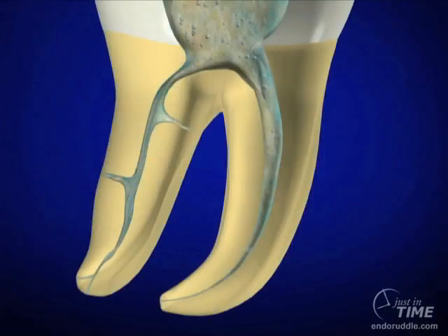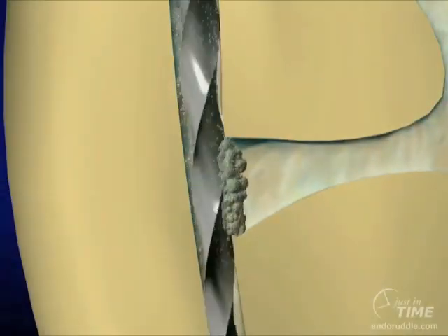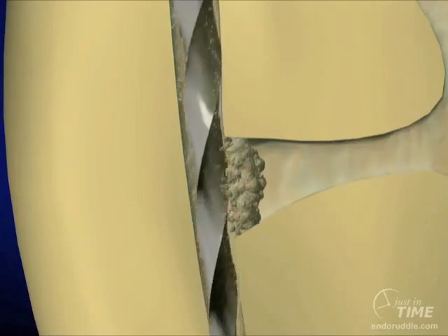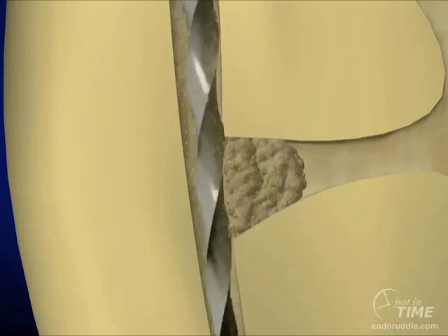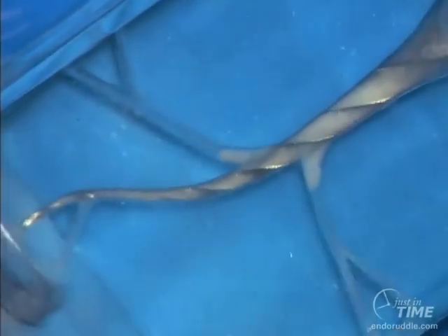Many clinicians relate a blocked canal to the inability to pass a 10-file to the full working length, but in reality, especially with the advent of nickel-titanium instruments and with particular emphasis on the cross-section of the file, many blocked canals are in turn blocked laterally. Rotary nickel-titanium instruments, especially the radial-landed variety, tend to burnish more debris into the lateral canals, eccentricities off the rounder canals, and dentinal tubules than cutting instruments.